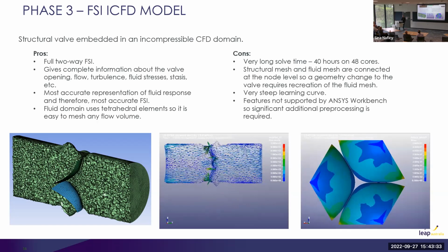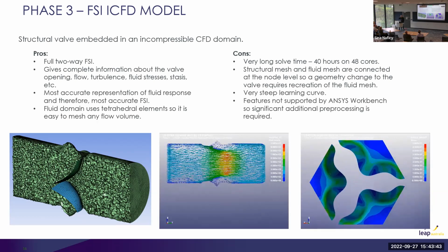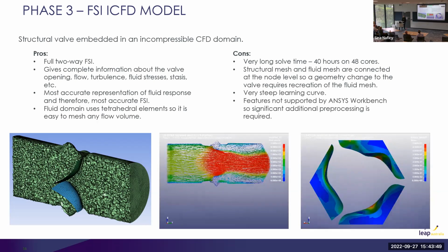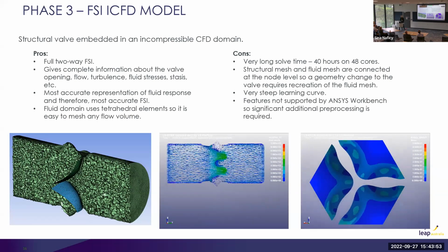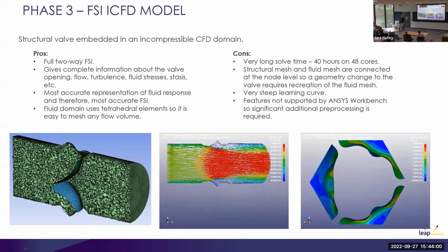Yeah, the downside is it takes about 40 hours to solve on 48 cores. So if you want these pretty pictures, you have to pay for them. So we want to eliminate all of the garbage designs before we put all the effort into this. It's also a very steep learning curve, learning how to do this. I had to learn how to do this, and then I had to teach them how to do it, and a lot of hair was pulled.